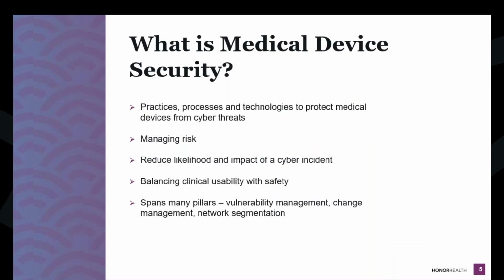So what is medical device security? When you boil it down, it comes to the practices, the processes, and the technology that we use to protect clinical equipment, medical devices, and patients from cyber threats. A lot of times it's not if something happens; in a cyber world, it's not if, it's when, and how do we limit that risk to our patients and our organization. So medical device security comes down to managing that risk. You manage the likelihood of something happening and the impact of something happening.